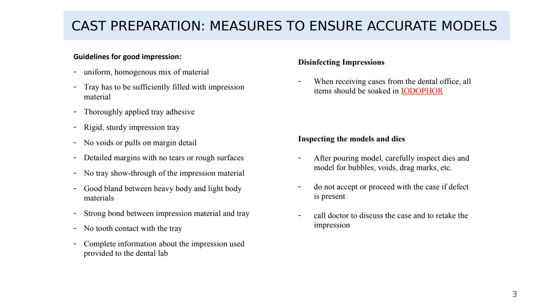The way the doctor moves the scanner, if he moves it too fast in the patient's mouth, or it goes out of the capturing zone, then there are voids in the impression. So the doctor might say, "Oh yeah, I did a scan of the patient, and I'll send you the scan." But again, you have to check if there are any voids in that scan that you receive, especially when we're talking about the margin and the prep. Okay.